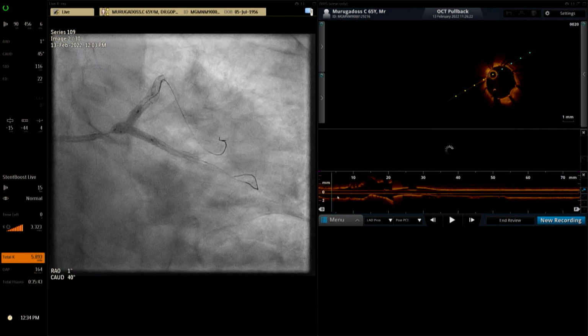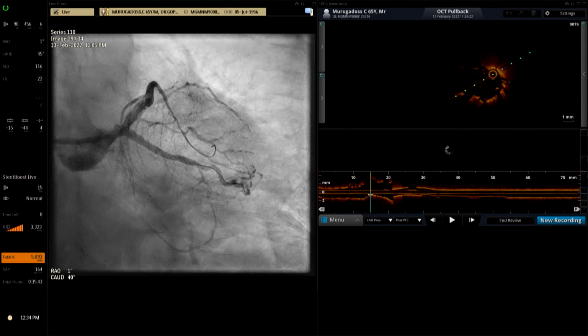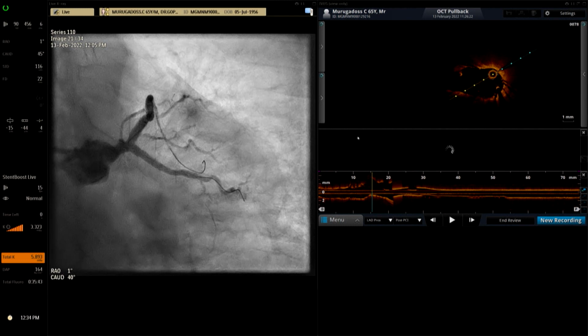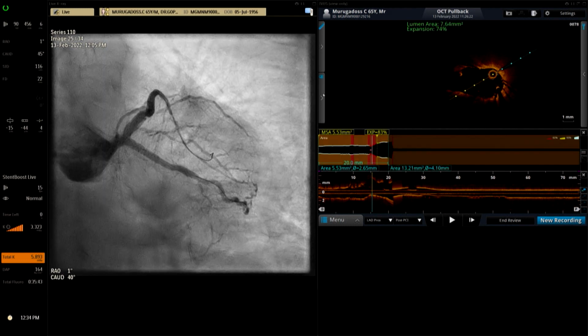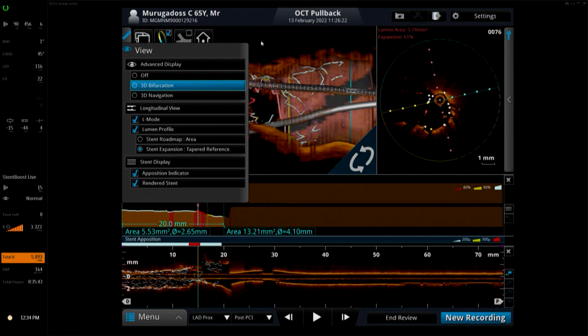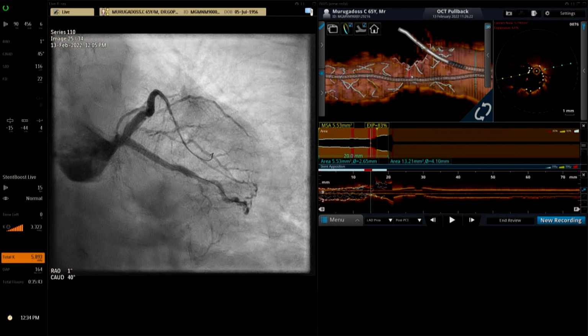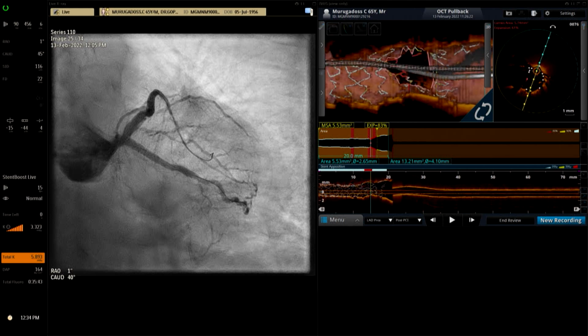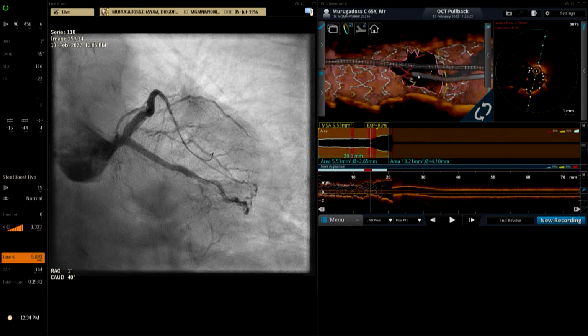Next, angio cutting. The angio looks very pleasing there. It actually looks better from whatever it was before. The outflows were all fine. The inflow of the stent at the left main was also very good, so there's nothing in the very ostial position that needs addressing. Show us the latest, please.